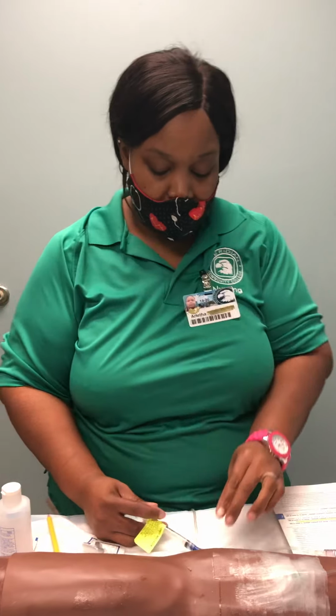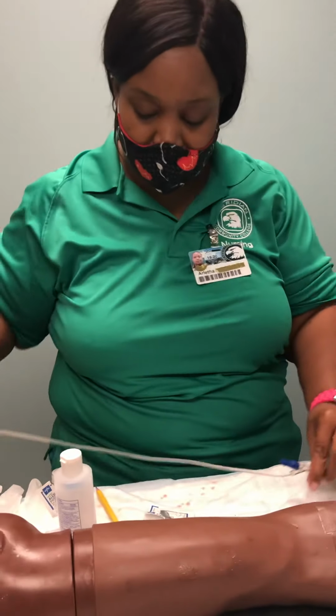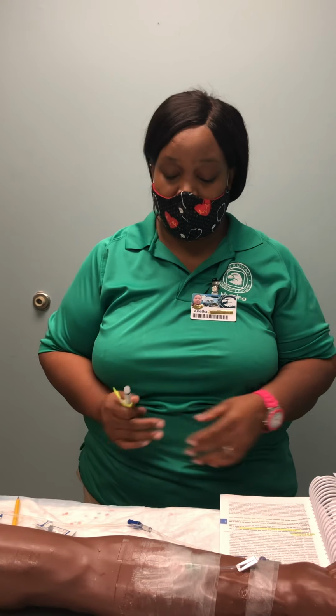Okay, after that, I unhook. I unhook it, and I monitor the patient for any signs and symptoms of an adverse reaction to this medication.